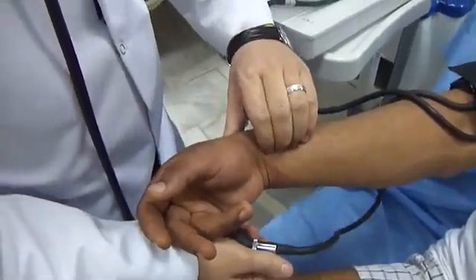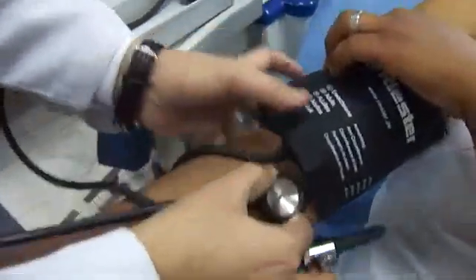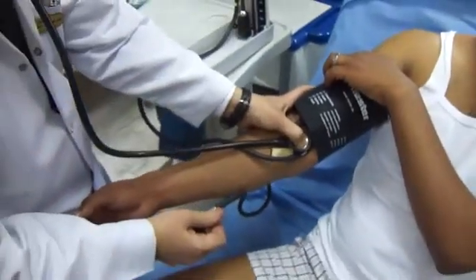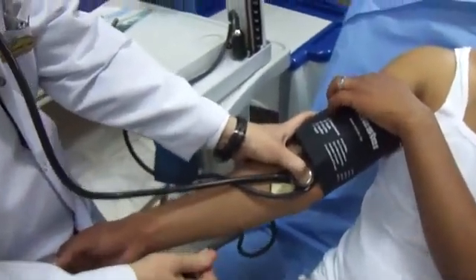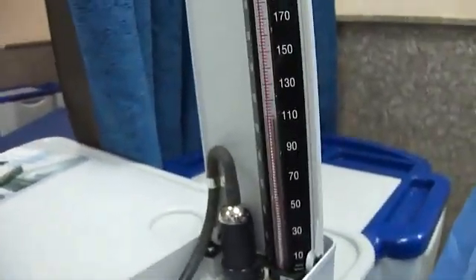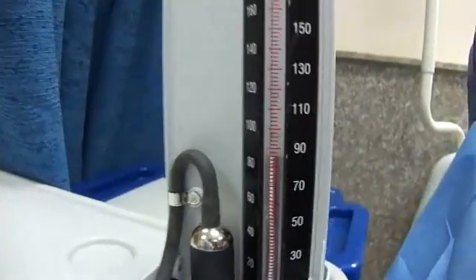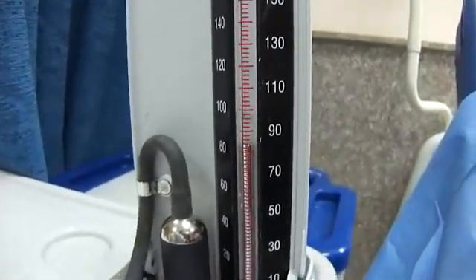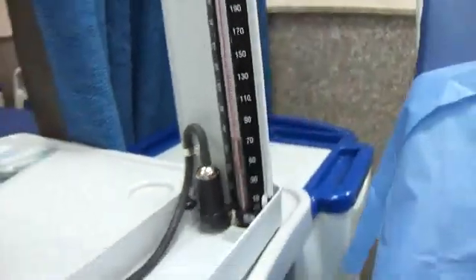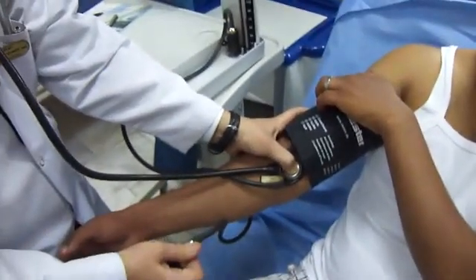The radial pulse is now palpable, so this is definitely the systolic blood pressure. I'll continue deflating slowly, 2 millimeters of mercury at a time, until the sound is first muffled and then disappears.